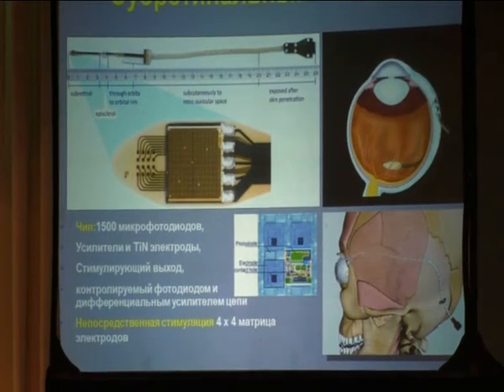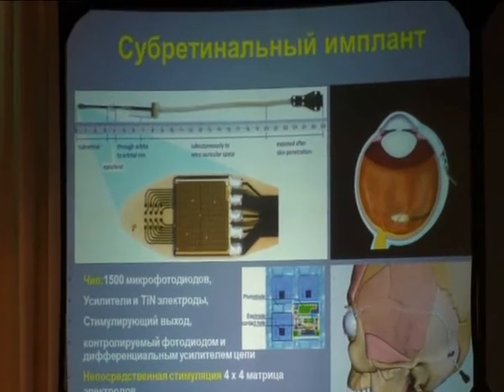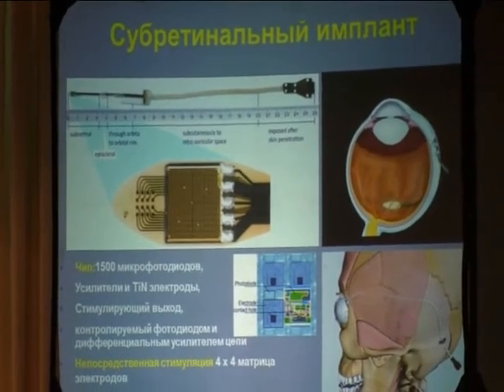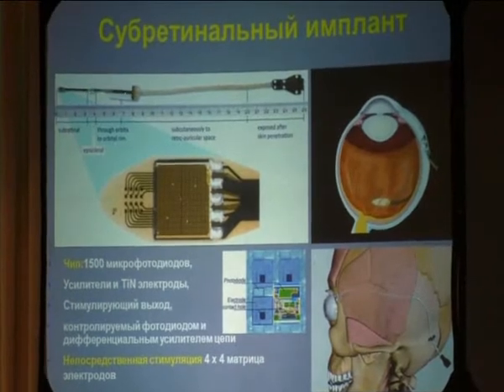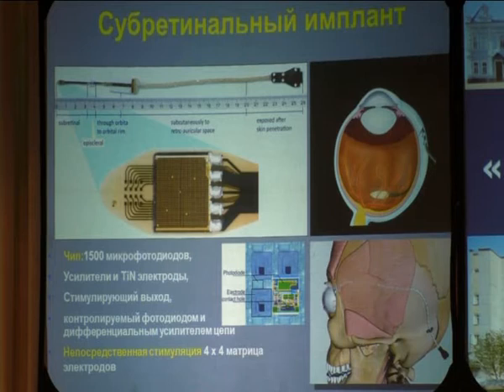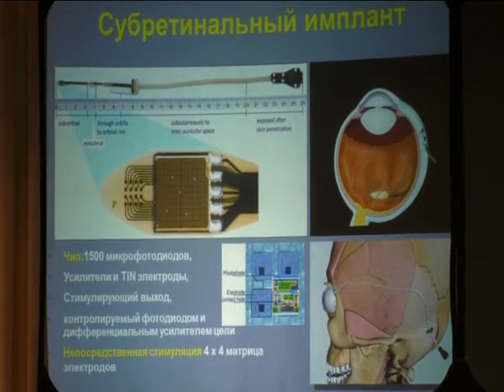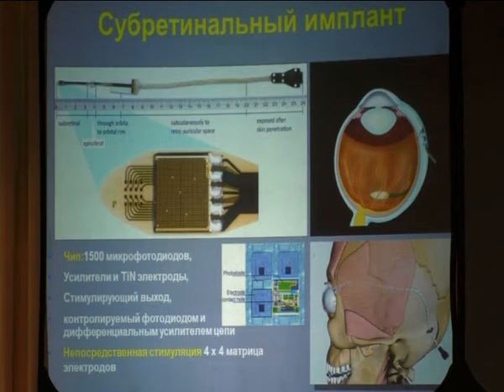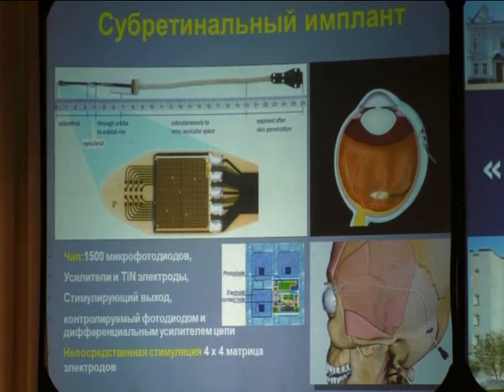This was our first implant that we are using in humans. Here you see the subretinal chip, and that's the part which is beneath the retina. And then there comes the part which is onto the sclera, and then a cable going through the orbit, and there beneath the skin, until a retroauricular region where the cable was coming out in the first part. And this chip has about 1,500 photodiodes, so you have a lot of pixels to get some information from the object you see.